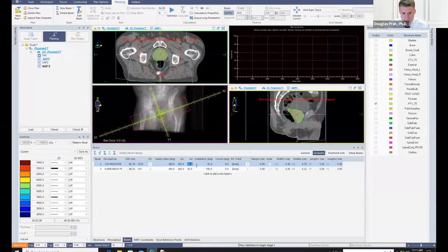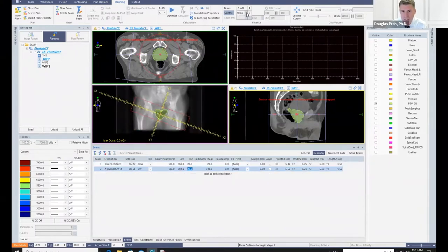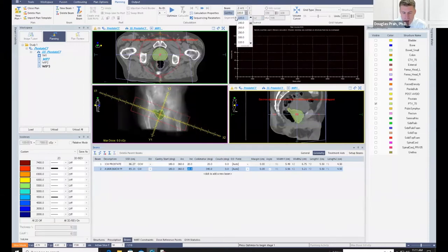In this case here, I have it set to 30. If I drop this increment to 20 on these, and then we take a look, now they're being incremented every 20 degrees. The value here is that you can produce better dose distributions at the end of stage one. Now, if you change the increment, you probably also need to consider a couple of things.